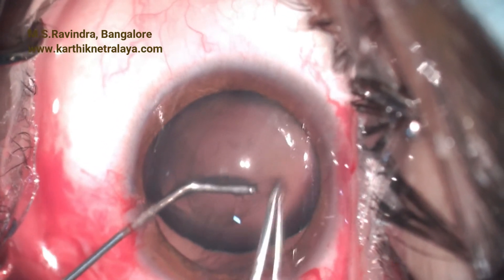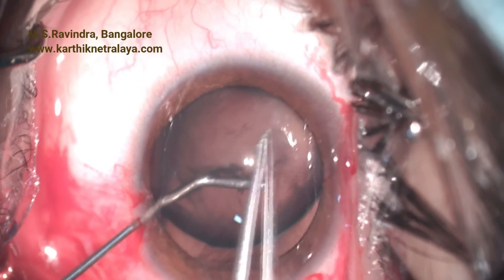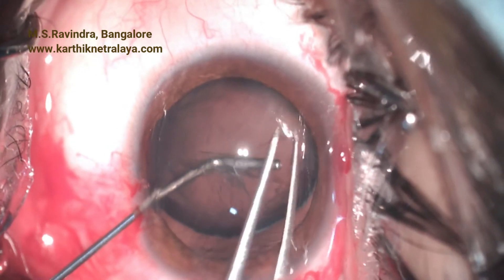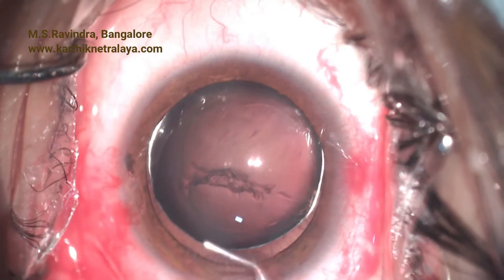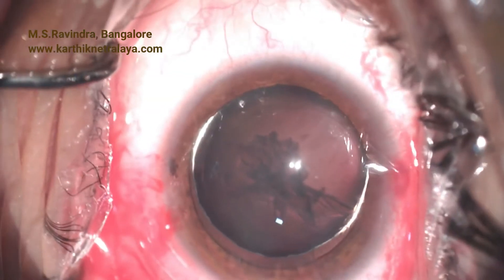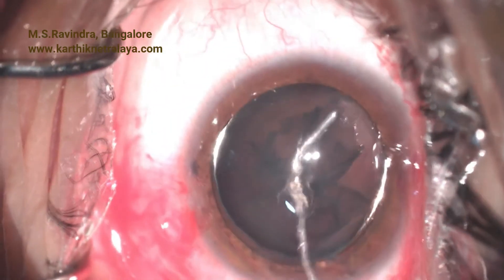Viscoelastic fills the eye, supporting the lens, and the capsulorhexis could be completed. The lens is held like a handle holds the bag — I call it the bag handle technique. Rhexis is otherwise very difficult because the zonular support and counter-traction is not there. The rhexis does go to the periphery but it can be easily retrieved and completed.